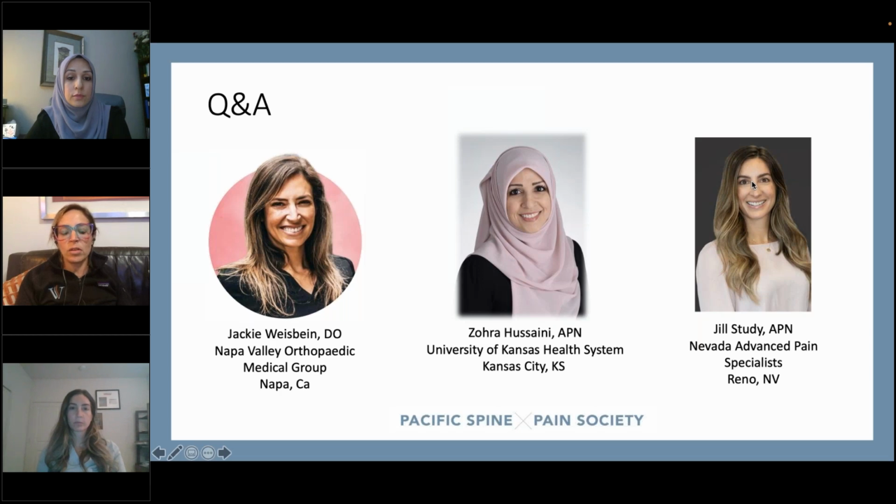And then also really utilizing flexible dosing for those patients, because we know that the way the fluid in our system is moving, it's not just kind of like a stagnant thing, right? There are a lot of these kind of waves and motions. And so when we bolus those patients or dose them with flex dosing, just like we do in baclofen patients, we see a lot better results.